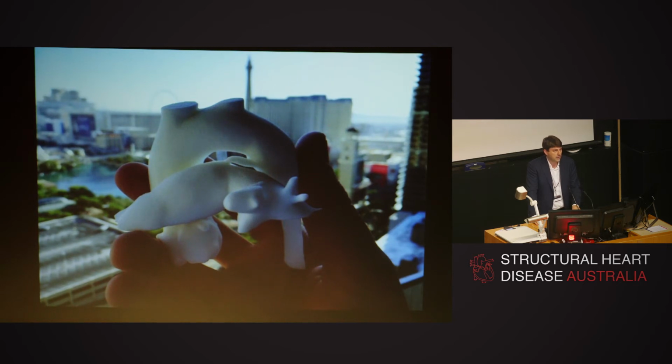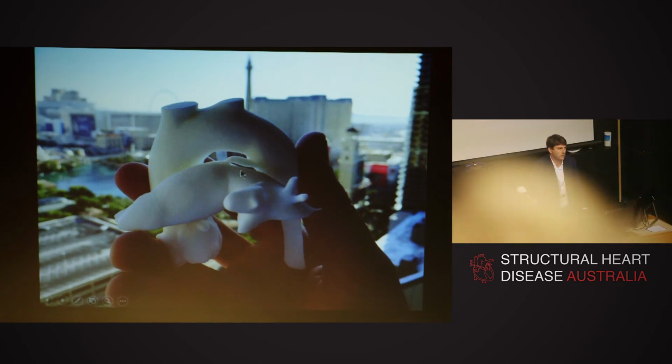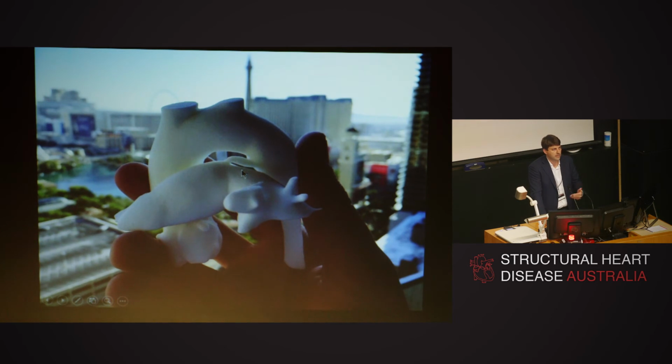Congenital heart disease, though, I think is where mostly it is going to be used. This is a very simple case of a very small ASD. And just to illustrate, this was something that I printed for a conference. So before getting on the plane, I uploaded it to Shapeways. I paid $35, and 3 days later I was in the hotel room. So 3D printing can be done very routinely now.